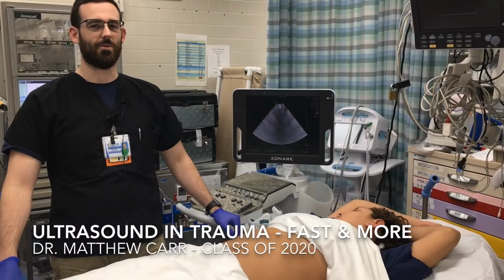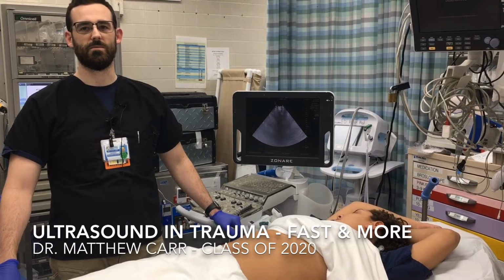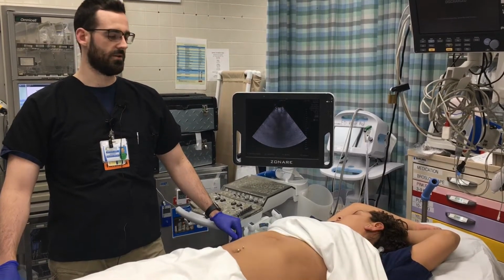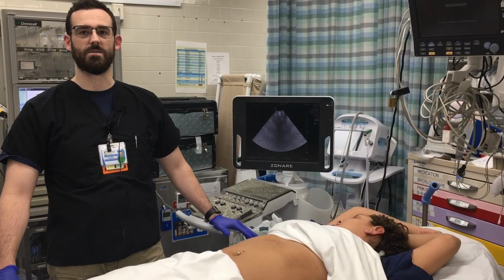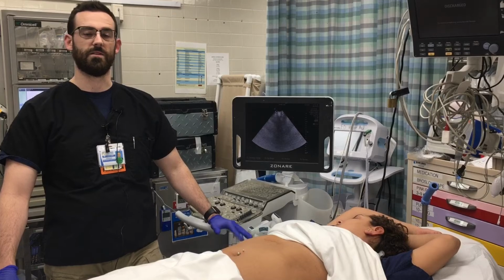Hey, I'm Dr. Carr. I'm one of the second-year ER residents at Brookdale, and today we're going to go over a FAST exam, which stands for Focused Assessment Using Sonography in Trauma. So today we're just going to go over what the technique is, what the areas you're supposed to look at, and then what each area is supposed to look at if it's normal.